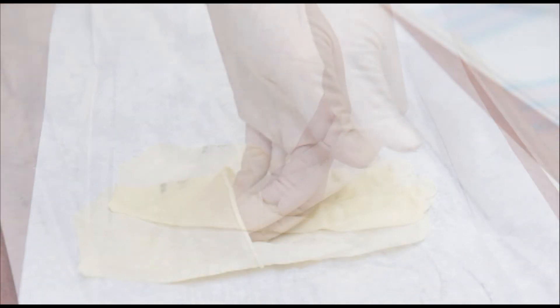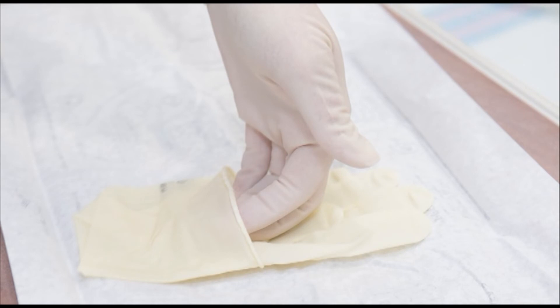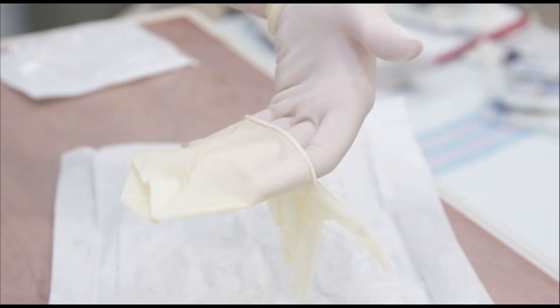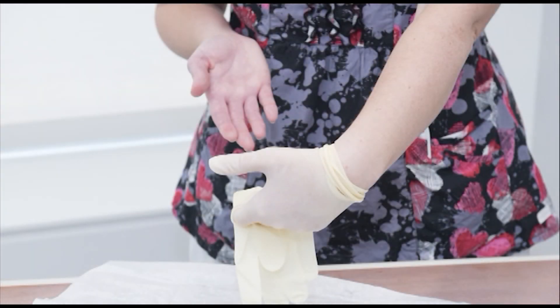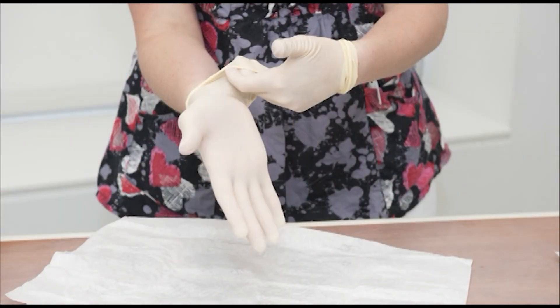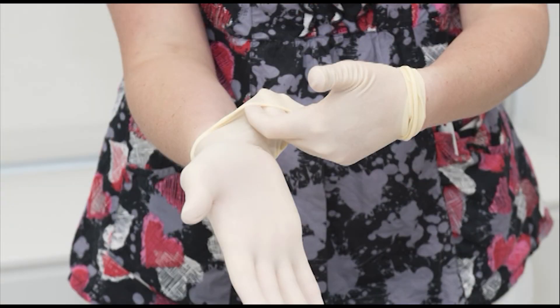With your gloved hand, slip your fingers into the folded cuff of the other glove and pick up the second glove. Slip the glove over your fingers, keeping the hand that you are putting the glove on flat. Keep the gloved thumb up and back to keep from touching your bare palm or wrist. Pull the glove over your hand, then adjust each glove to get a snug fit by reaching under the cuffed part to pull up or adjust.